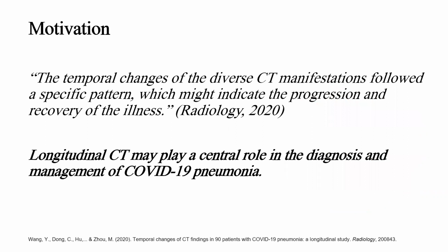According to a study reported in 2020, temporal change of diverse CT infection patterns might indicate progression and recovery from COVID-19. That means longitudinal CT may play a central role in diagnosis and management of COVID-19 pneumonia.